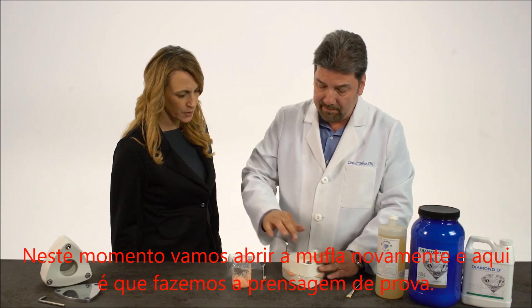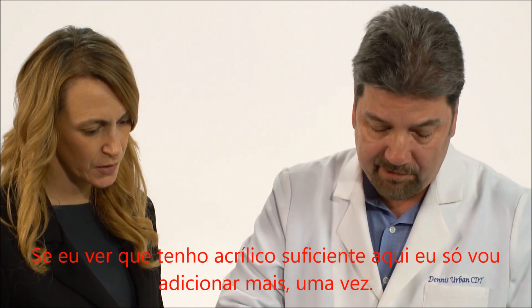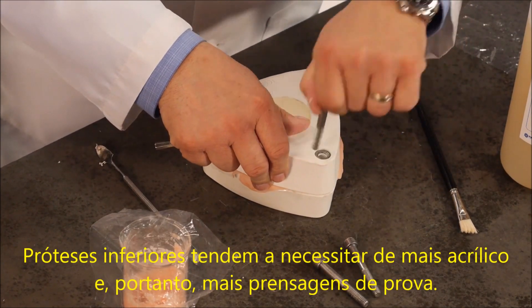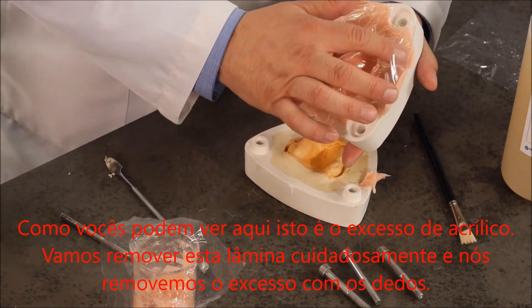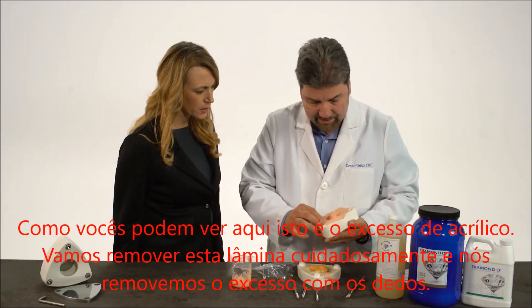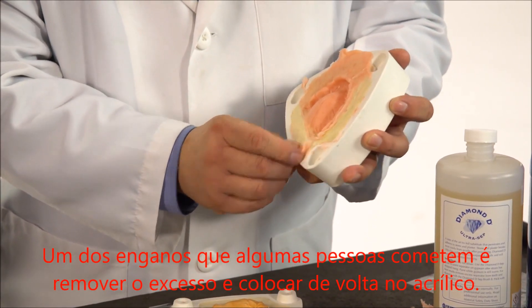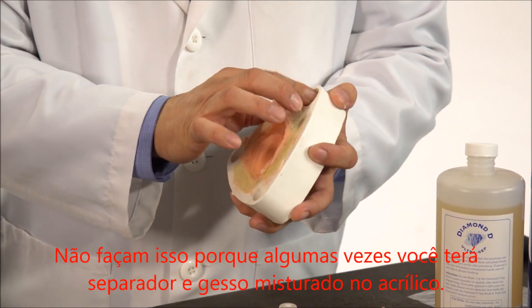At this point we're going to open up the flask again, and this is where we're going to trial pack. If I see I have enough acrylic in here, I'm just going to add to it once. Lower dentures tend to take more acrylic, therefore more trial packing. As you can see, this is all the excess on the acrylic. Let's peel this away very carefully, and we take our excess off with our finger. One of the mistakes some people make is they peel this excess off and put it back in the acrylic — don't do that, because sometimes you'll have separator and plaster mixed in with the acrylic.